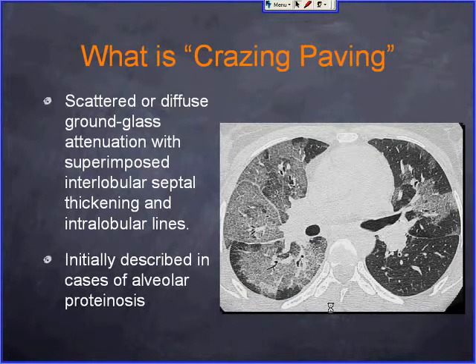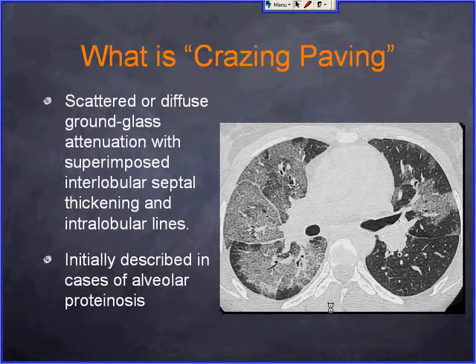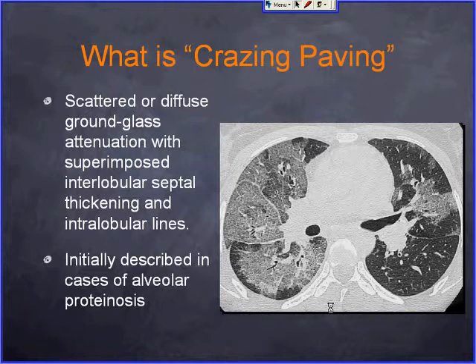The definition of crazy paving is scattered or diffuse ground glass attenuation with interlobular and intralobular septal thickening. As we can see here, you can appreciate the diffuse ground glass attenuation on the right and a scattered area on the left, with diffuse intralobular septal thickening and interlobular septal thickening.